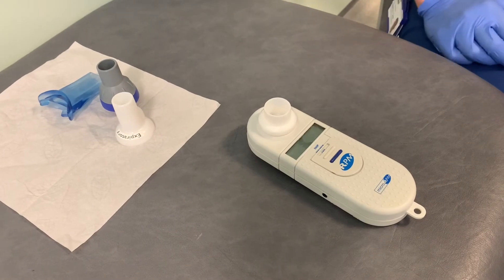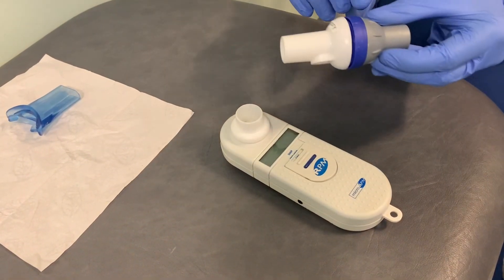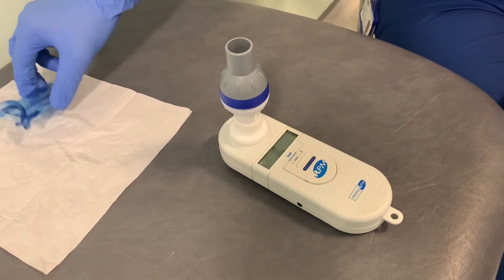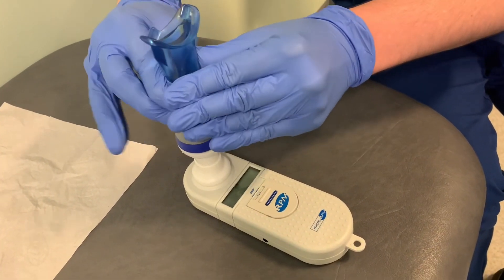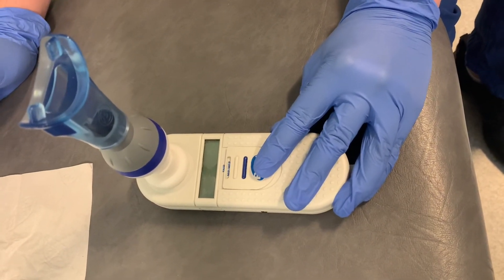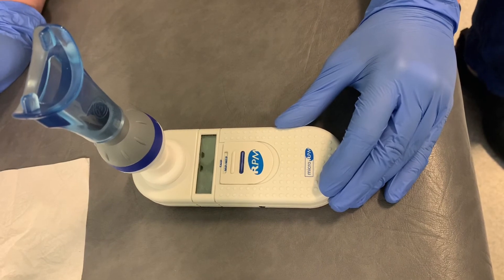To do a maximum expiratory pressure, connect the filter to the expiratory valve assembly, then connect the expiratory valve assembly to the top port on the device. Connect the mouthpiece to the end of the filter. Turn the device on by sliding the dial up to MIP and MEP. When the device beeps, it's ready for a measurement.